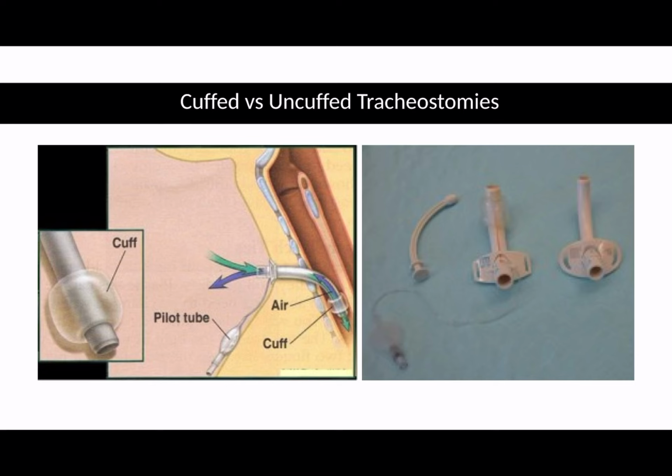So often, before patients are trialled on cuff down periods, what the doctors will usually do is exchange the tracheostomy to a slightly smaller one, so a size 8 or a size 7 tube, and so on. This allows more space around the tracheostomy and therefore easier for them to breathe. Not everybody does that, but that's relatively common practice.